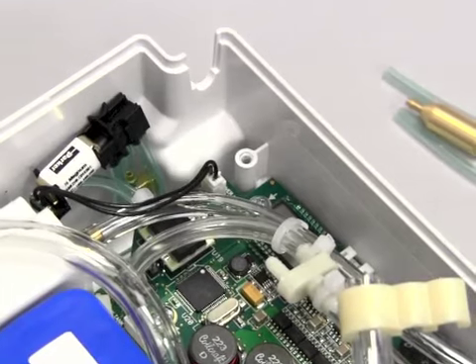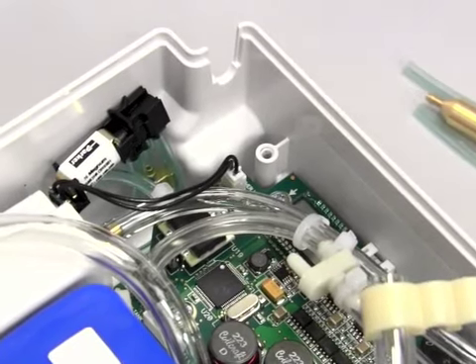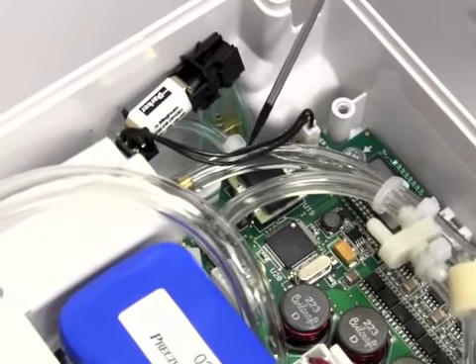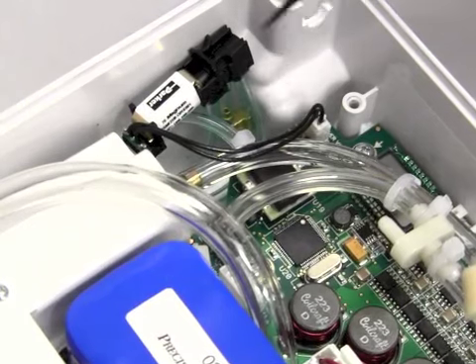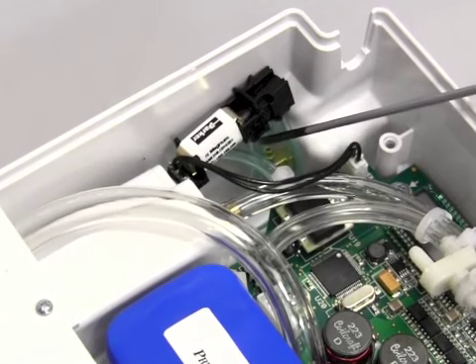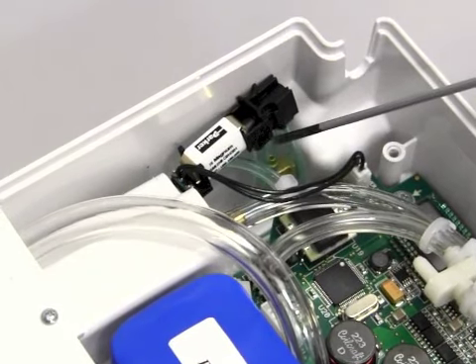To install the isolation valve into the POC, there are two pieces of tubing that have to be cut and removed from the device. The first is the tubing that is connected to the sensor that I'm pointing to. That will have to be removed from the pressure sensor. The other piece of tubing is on the third port on the valve, that I'm pointing at. That tubing also will have to be altered to install the isolation valve.